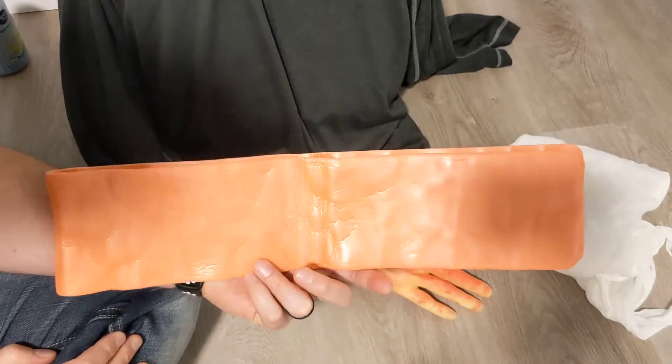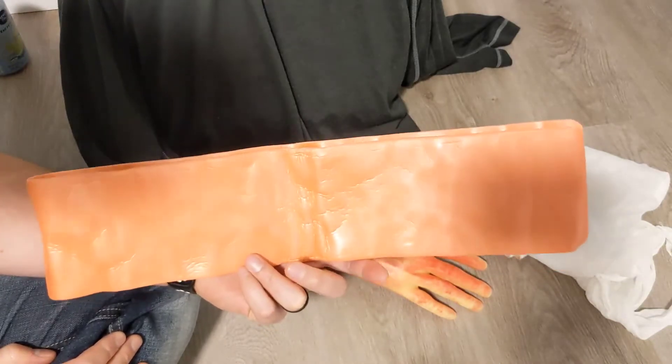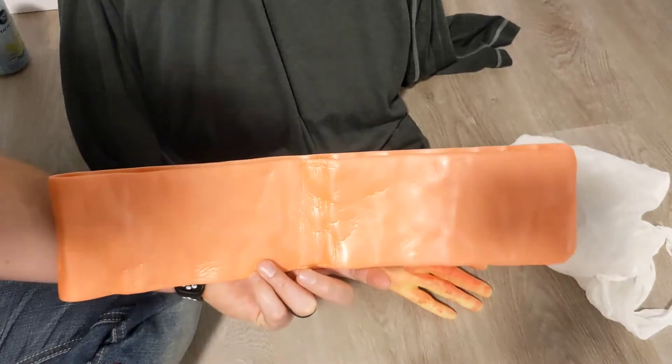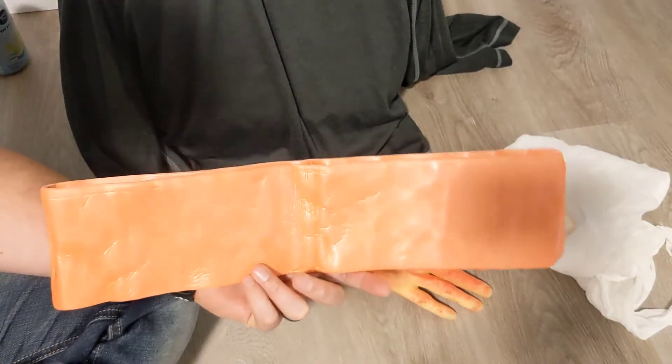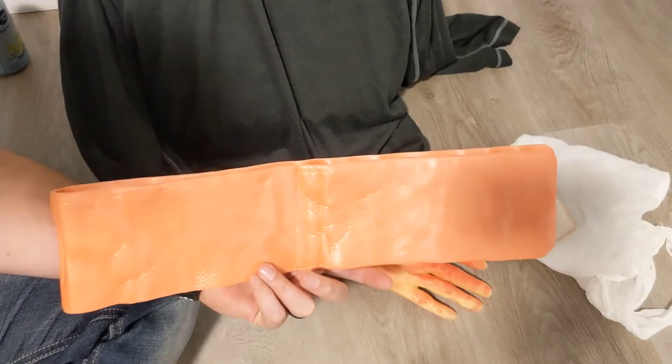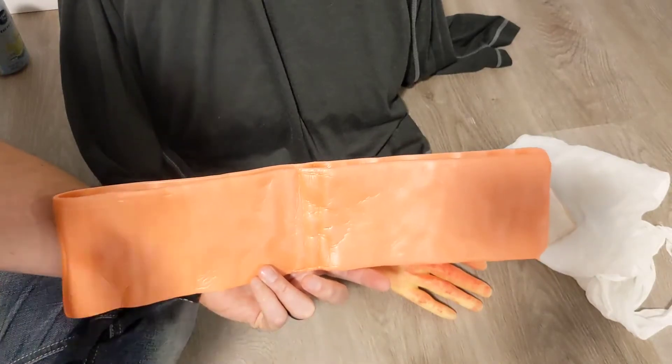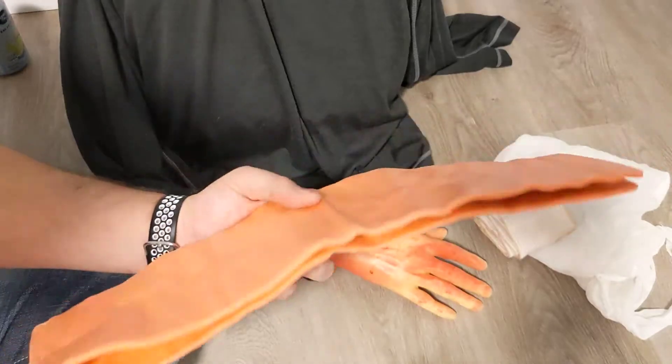Another advantage is that it is x-ray translucent. So if the patient needs imaging done at the hospital, the splint doesn't have to be removed — it can stay on through that process. This causes less pain to the patient overall compared to using sticks, metal rods, or tent poles. This is just going to be a little bit better.